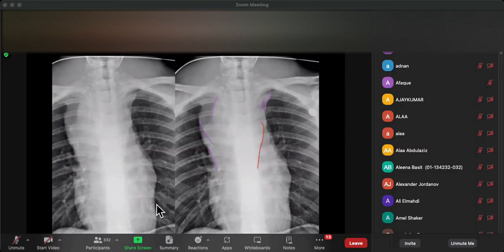This just gives you a feel for all the lines and stripes and interfaces that you can see, because we've got both an anterior and middle mediastinal mass. Now, if you get anterior and middle mediastinal masses coexisting together, that's almost always due to lymphoma, because of course lymph nodes affect or are normally seen in all three compartments.